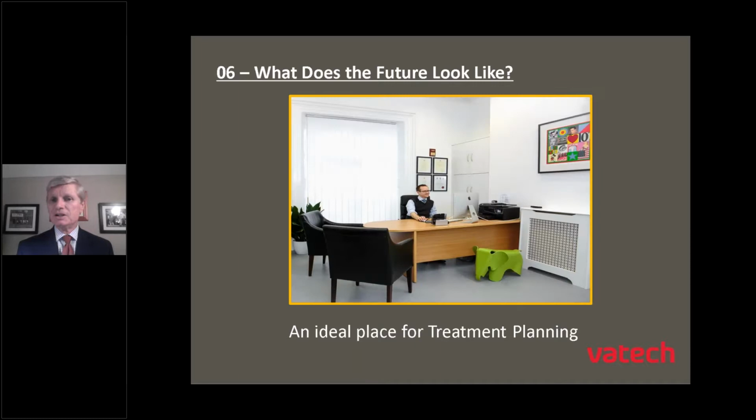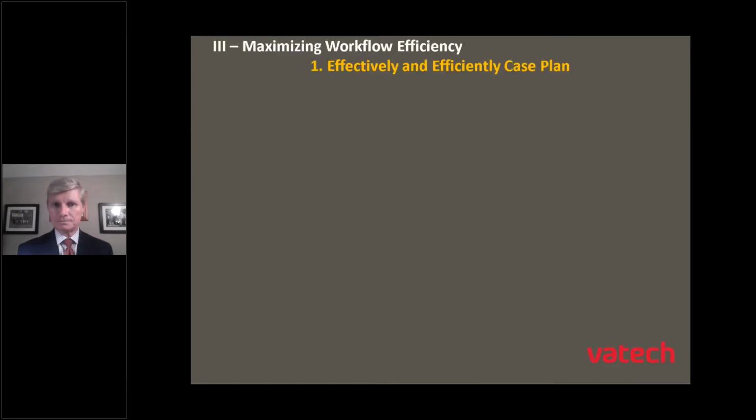So from that perspective, if you can separate yourself from the patient just for a few minutes to navigate the scan, again, even if it's just to verify that you captured the intended region of anatomy, making sure it's a clear, sharp image and the patient was stable during image capture, that's ideal. But if you can just spend a few minutes, as indicated in the previous cases, you notice that it literally only took me 1 or 2 minutes to go through, navigate, even do basic treatment planning of our case to the point where I can even present that then to the patient.